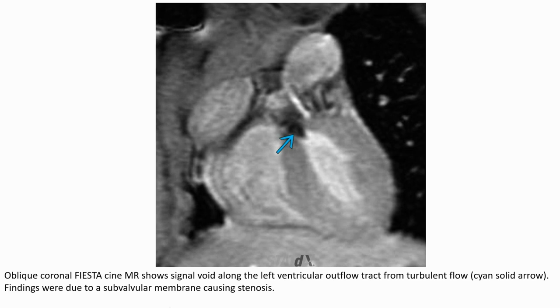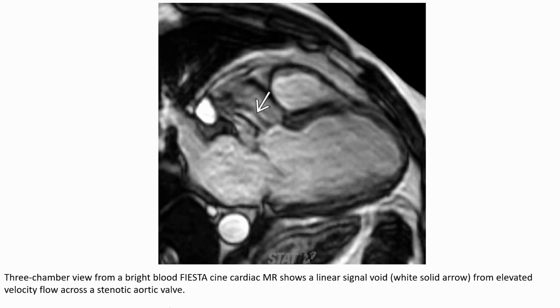Coronal oblique MRI also shows a signal void along the left ventricular outflow tract from turbulent flow, with findings due to a sub-valvular membrane causing stenosis. The three-chamber view from phase-contrast MRI shows a linear signal void from elevated velocity flow across a stenotic aortic valve. The cross-sectional view through the aortic valve from phase-contrast MRI is also demonstrated.